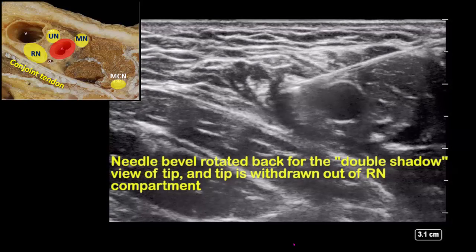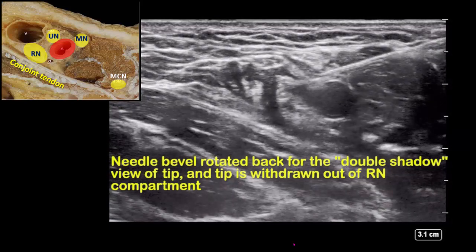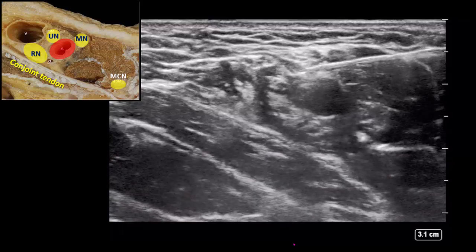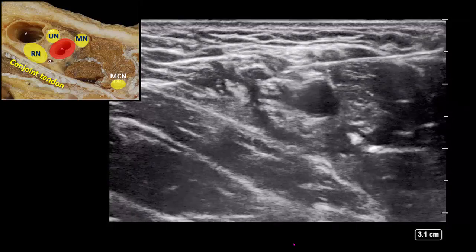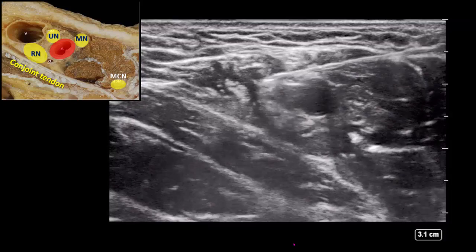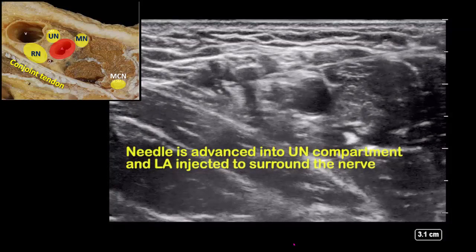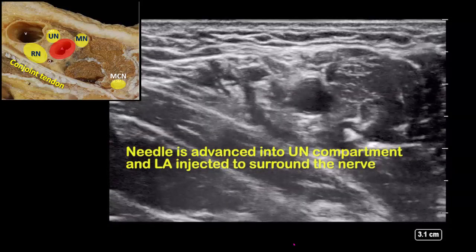After injecting eight to ten mils here, withdraw the needle back into the ulnar nerve compartment and inject five to eight mils to surround the ulnar nerve. Advance the needle as necessary to pierce any fascial sheaths that might be impeding spread around the ulnar nerve.